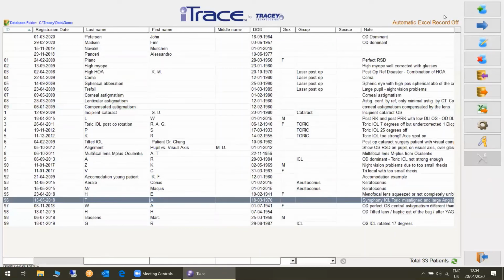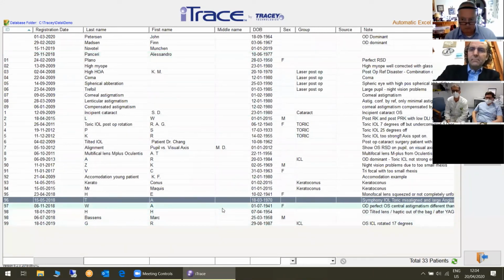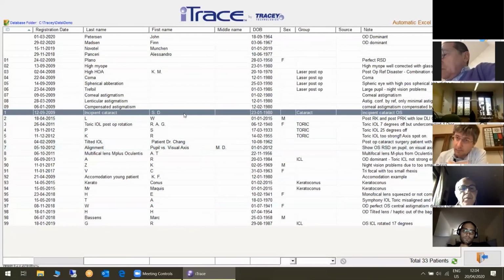Speaking about the importance of MTF corneal evaluation for the correct enrollment of our premium patient, which kind of diameter do we need to consider? Because when we acquire both corneal and wavefront, of course, the wavefront corneal map is related to the diameter of the wavescan acquisition. So, which kind of diameter do we have to consider when we evaluate the MTF high order corneal aberration?